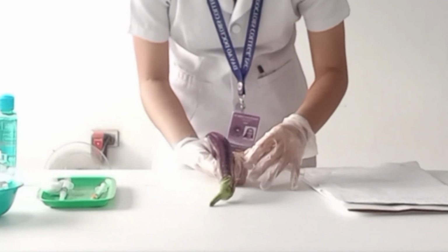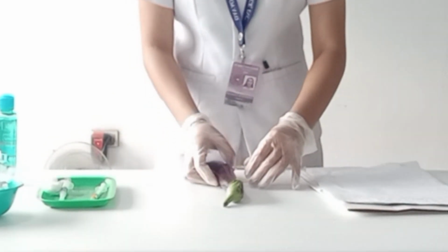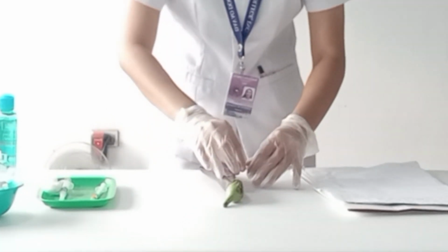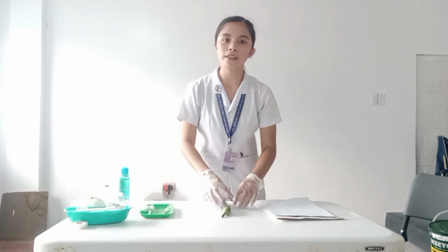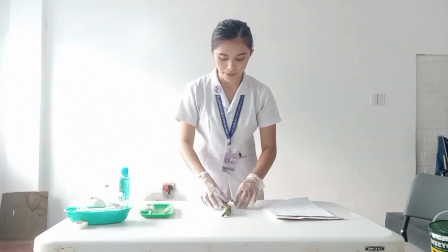Now stabilize the syringe and needle and inject the medication carefully and slowly so that it produces a small wheal on the skin. So now we withdraw the needle quickly at the same angle at which it was inserted, and then activate the needle safety device and apply a bandage if it is indicated.